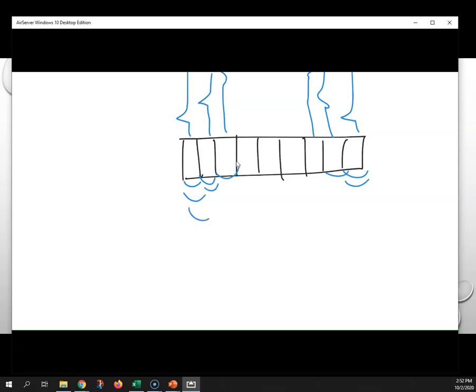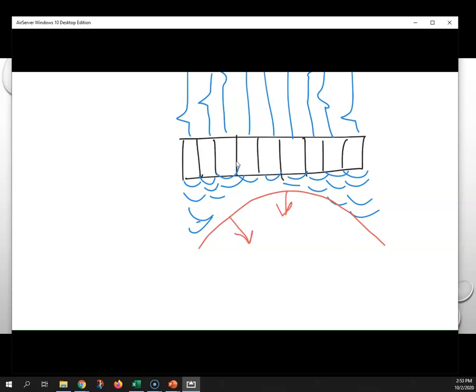And so these are propagating outward, and we just continue doing that with our pulses until we get this convex shape to our beam. And the wavefront, when you think of the wavefront, it is now shaped convexly, and as I said, it moves perpendicular to itself, so it's moving in this direction here, this direction here, and this direction here. And you can see that those are all converging on some point that is going to become the focus. If you look at these timing delays, that tells you exactly how the beam will be focused when it's created.